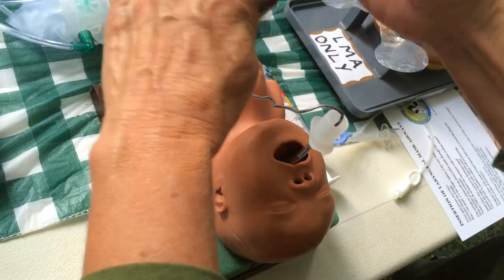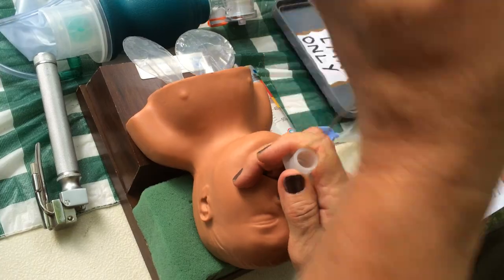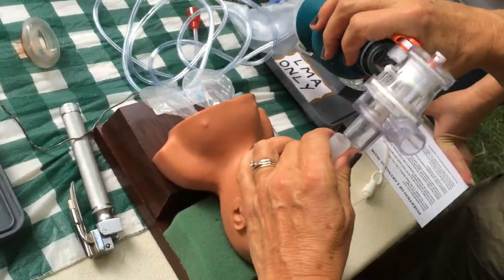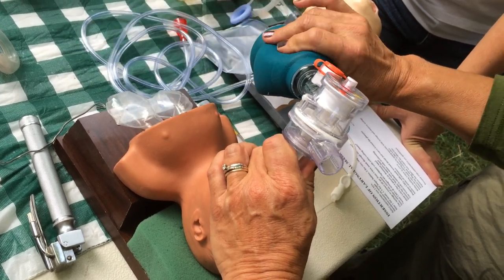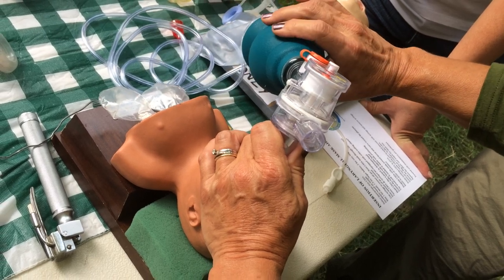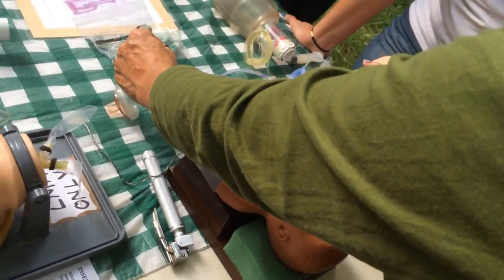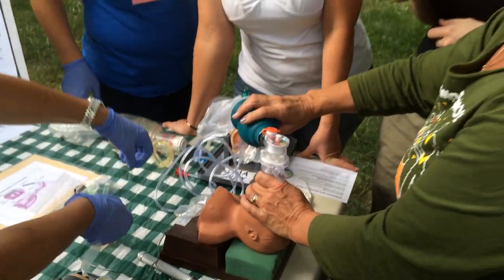Now I take this out. I take my guide out. I take the mask off. And I bag the baby. Breathe, two, three. Breathe, two, three. Breathe, two, three. Right? The baby is still not breathing, and the heart rate is 40. Help me with chest compression. Somebody.